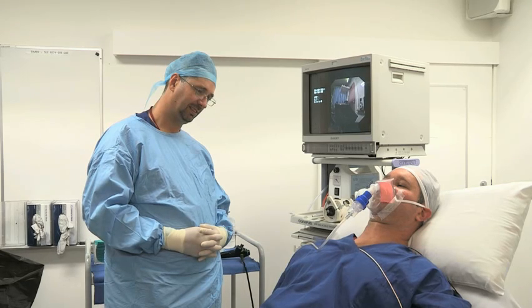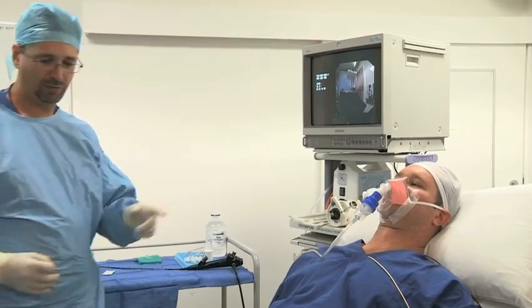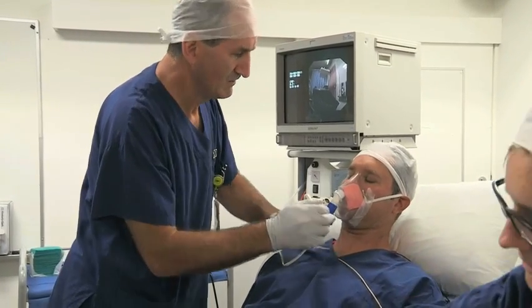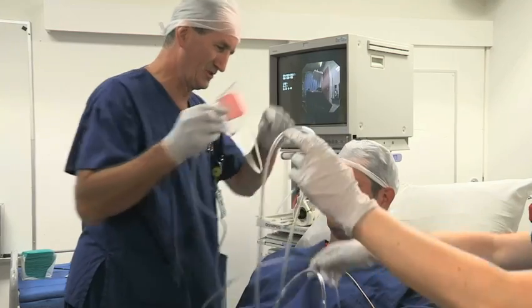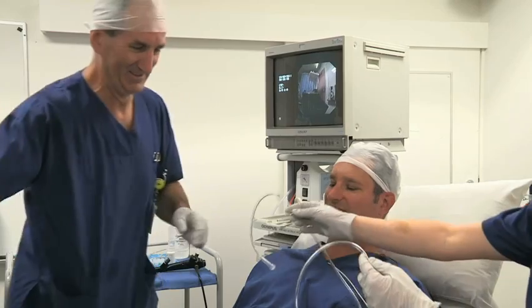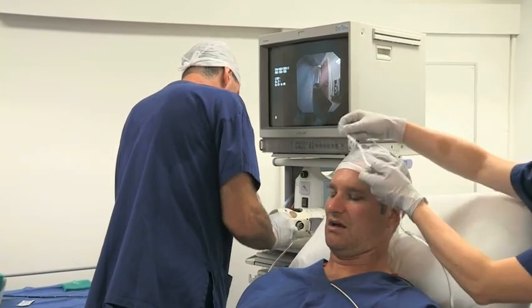The patient should be prepared by establishing intravenous access and full monitoring. If a lignocaine nebulizer is used, it should be timed to finish just as topicalisation begins. Unless contraindicated, an antisialagogue will enhance topicalisation by providing dry mucosa in addition to improving the endoscopic view. We use glycopyrrolate 4 micrograms per kilogram, given at least 30 minutes beforehand.